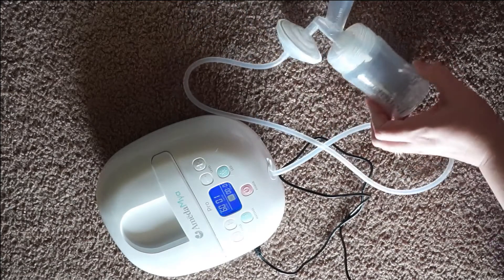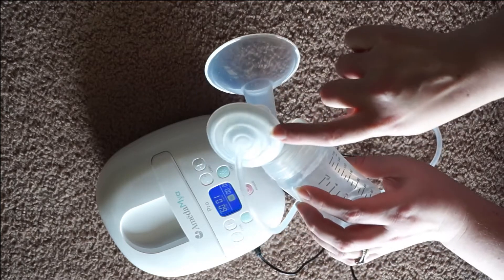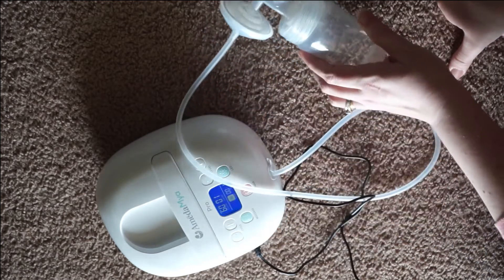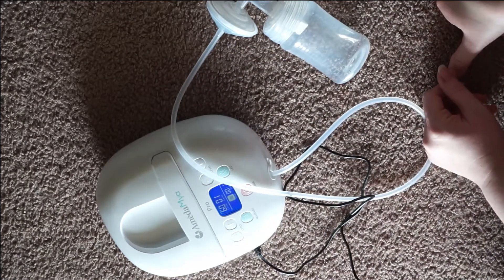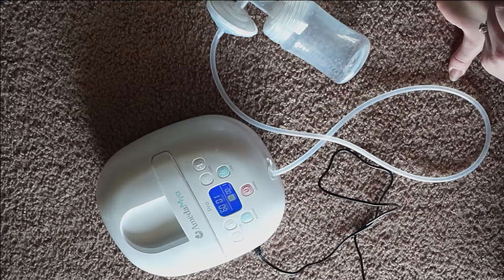Everything's attached and everything's working as it should. You should see the backflow protector moving in and out. It should sound like it's working, which it is.